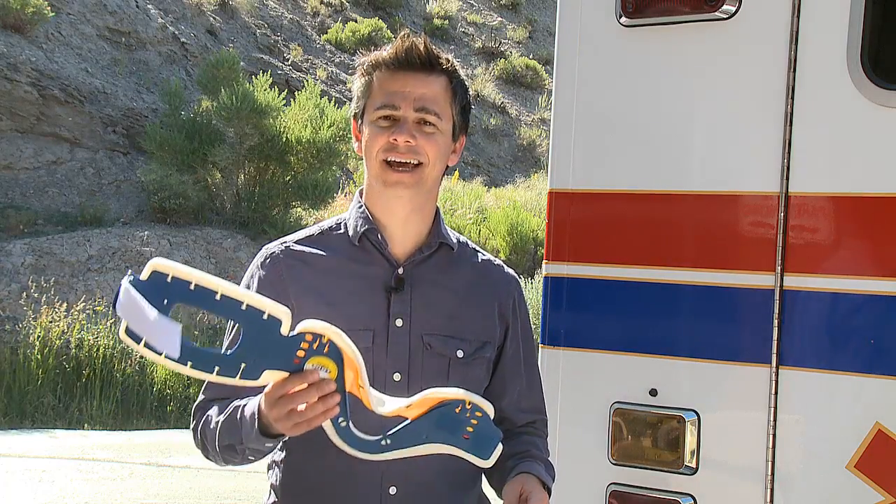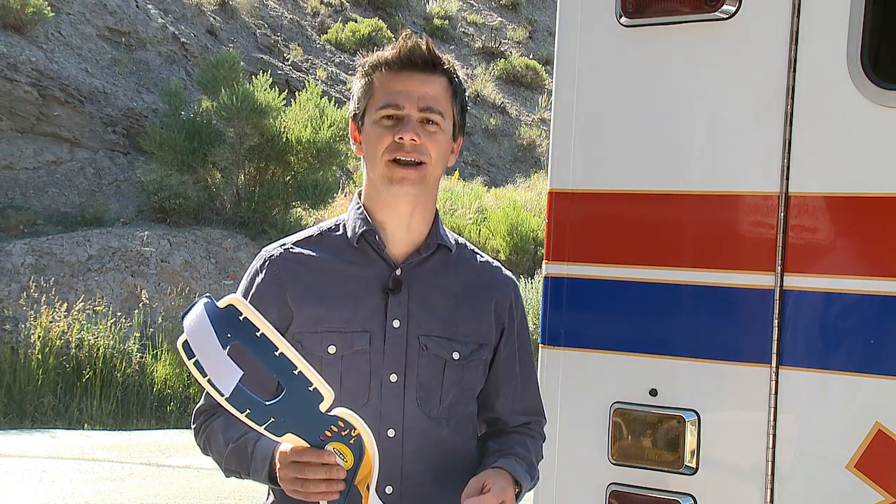C-collar technology is changing. Today we're going to show you a brand new innovative product that is going to show you the neck and everything. You can see right through it. It's really cool. I'm Chris Montero and this is the Innovation Zone.